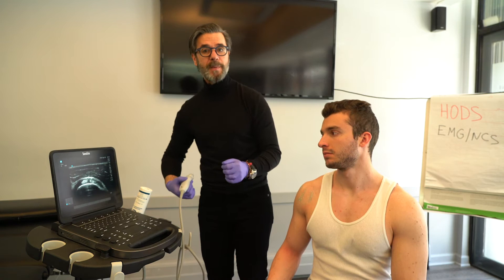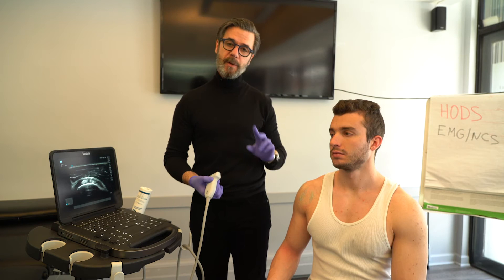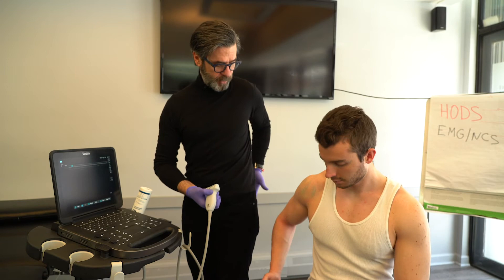I'm also going to show you the supraspinatus, which is the most important tendon of the shoulder because most injuries occur at the supraspinatus level. There are two views — the short axis and the long axis — and I'll explain how each looks on screen.